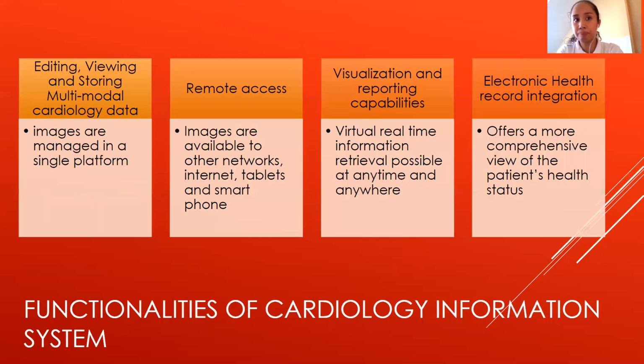So napakalaga. So other functionalities of your CIS for editing, viewing, and storing multi-modal cardiology data. So, kumbaga, images are managed in a single platform. Isn't it that class Facebook is so convenient because in a single platform, you could talk to your crush, you could buy stuff in the FB marketplace.